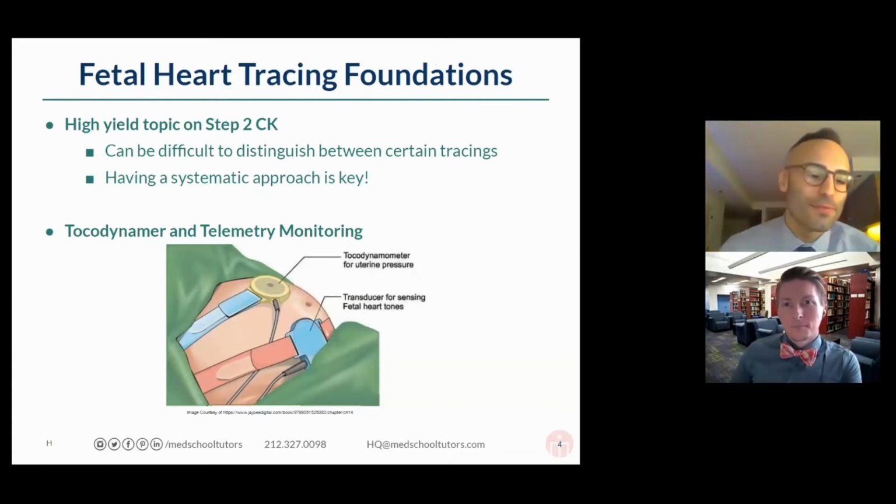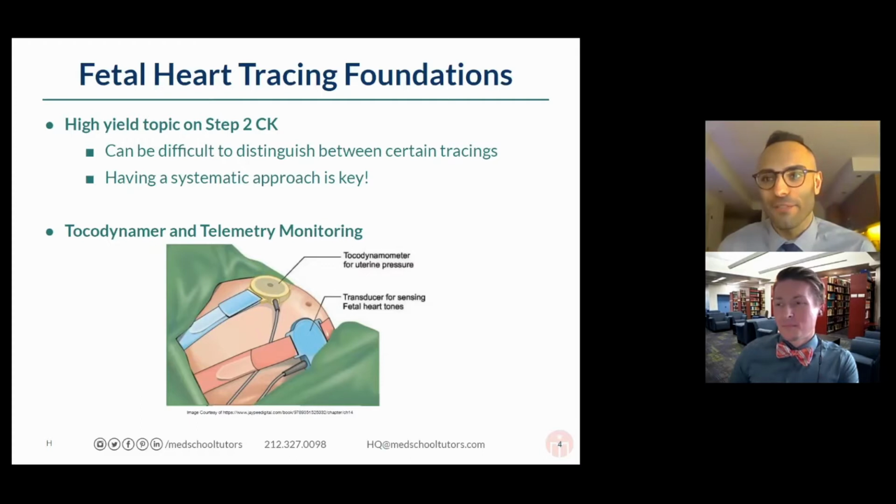Sure. Thank you, Joe. So fetal heart tracings, ObGyn. I'm sure you guys have heard a lot of things, and you know that OB/GYN is one of the more difficult subjects in Step 2. I think it's all about having a good foundation of knowledge, especially when it comes to fetal heart tracing. Step 2 CK loves to ask about ObGyn questions because the guidelines are very systematic, and there's a specific approach that you need to have to really master these questions. So, going over fetal heart tracing.